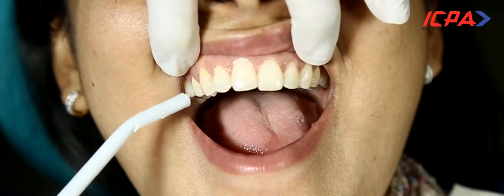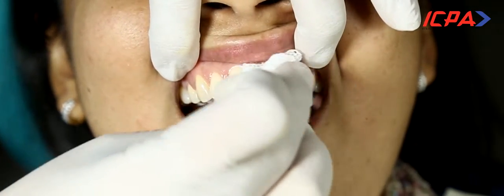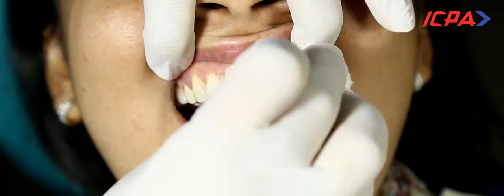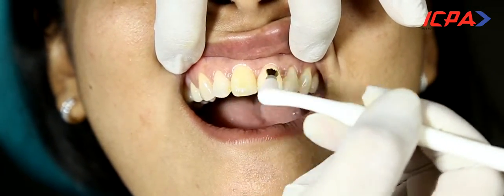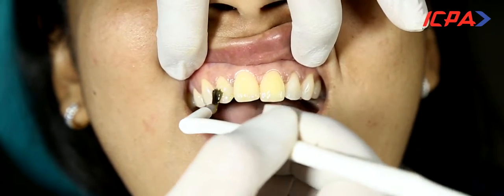Varnish is only applied after the visible debris and deposits are removed by scaling. Dry the teeth with an air syringe or a cotton gauze. The recommended quantity of varnish can be applied on the front teeth like this — one thin layer is more than enough.